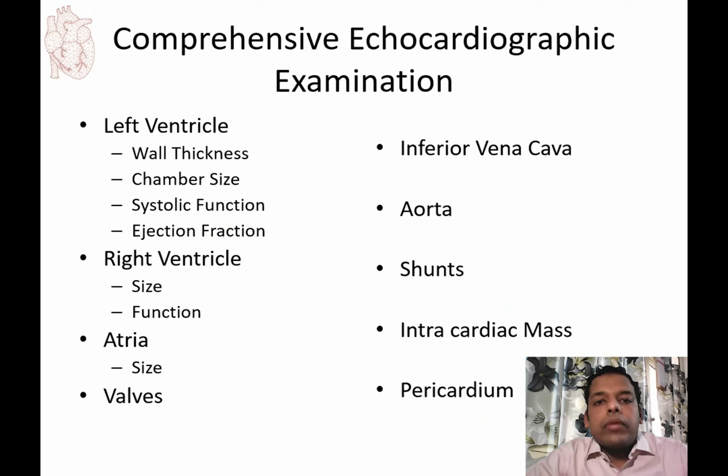We must know that it is extremely important to perform a comprehensive echocardiographic examination.